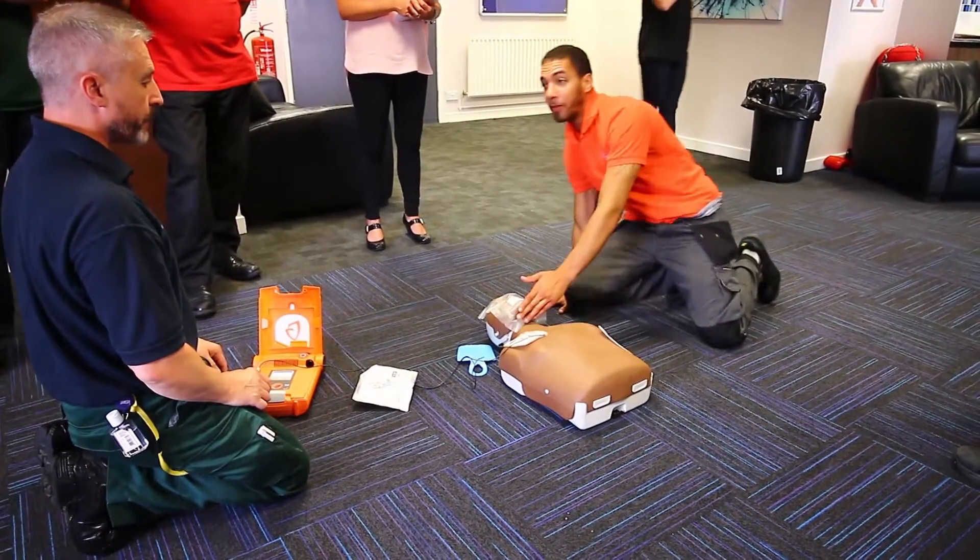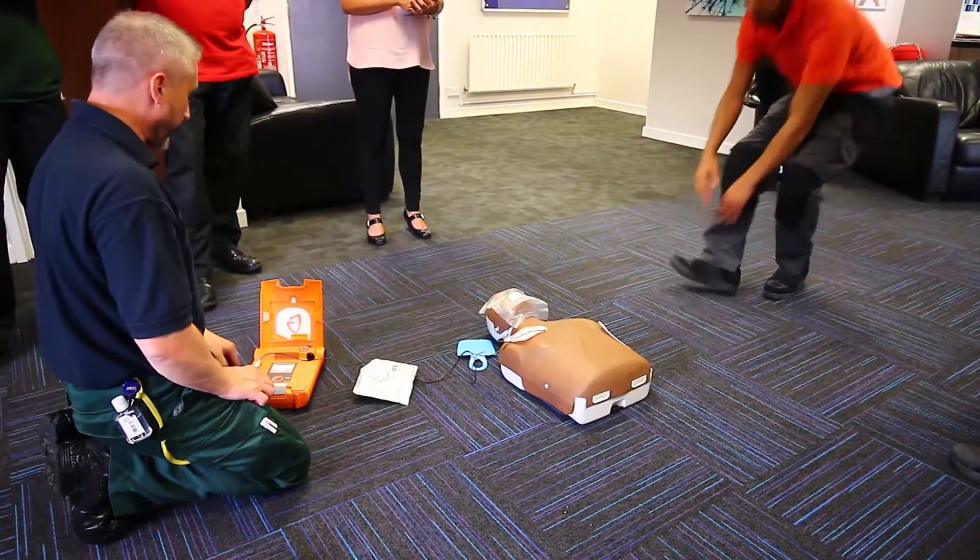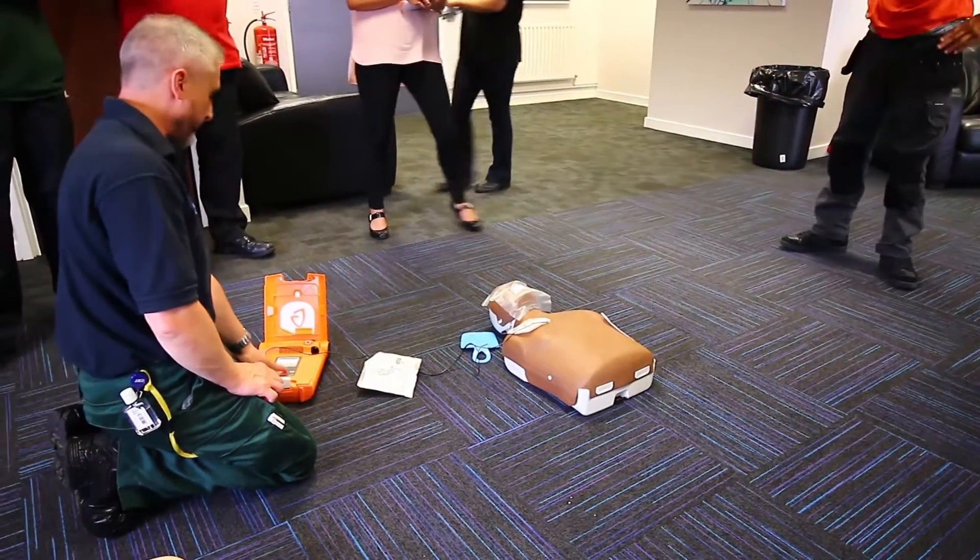Stand clear. Please wait. Stand clear, analysing patient.